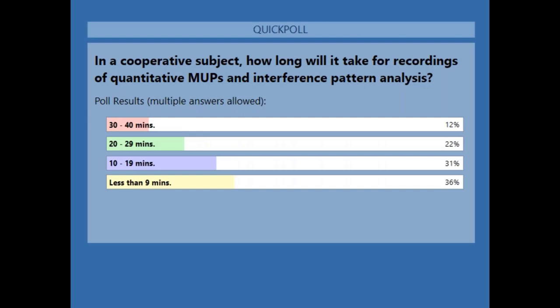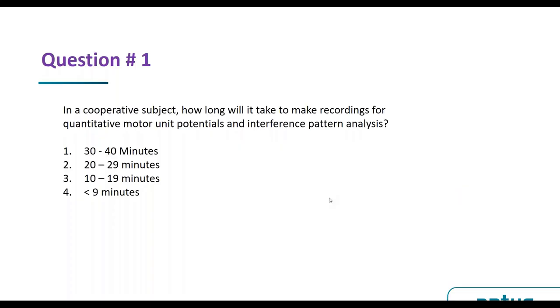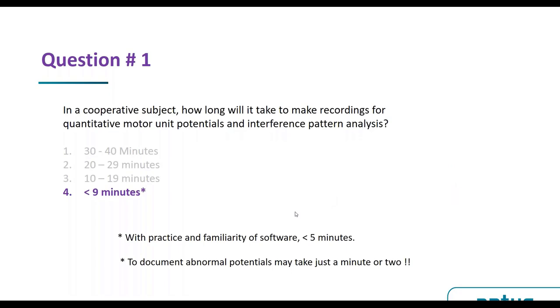Okay, so I'm very happy to see a lot of people selected a time of less than 9 minutes. That's the answer I really would like to see. Very good. Actually, with practice and familiarity of software, it can be less than 5 minutes.